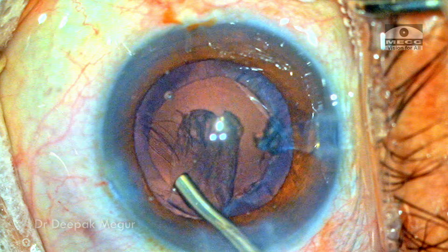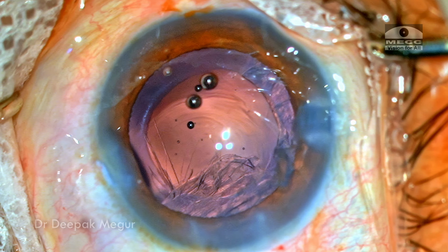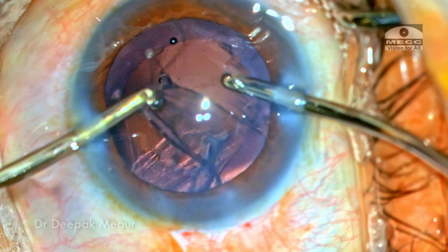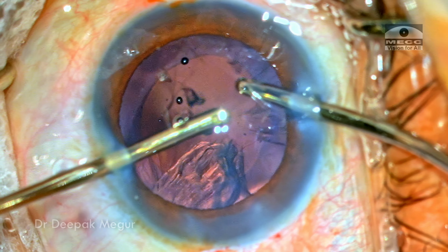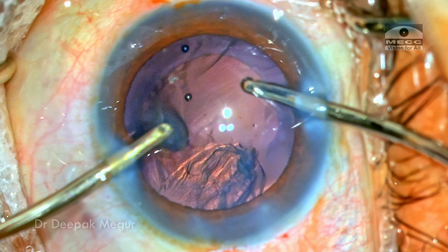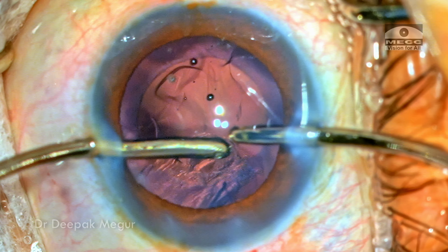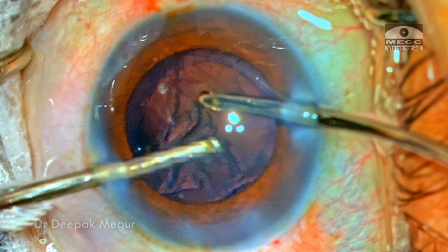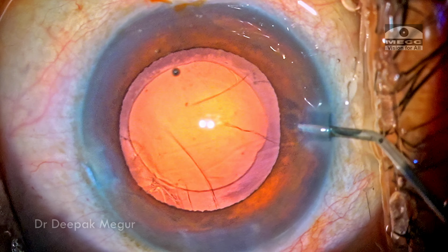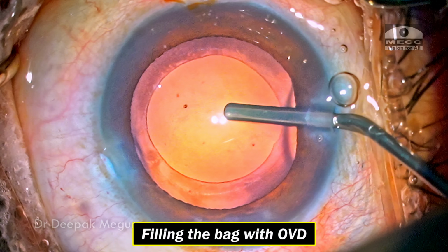Again, refill the bag with OVD and then switch hands. Now I'm going to aspirate the cortex from the other quadrant, so that cortex could be aspirated out. In that flow, the cortex near the zonular dehiscence area also gets aspirated. Just come out. I'm going to fill the OVD in the capsular bag.